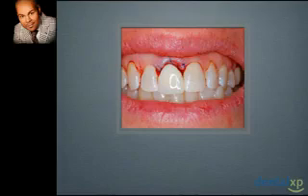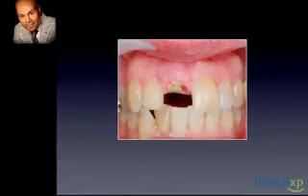So what I attempt to do here is to graft this, use the flipper to help me mold the tissue, and you can see some of the extrusion of that graft from the socket, and we'll allow that to heal. Typically at about 10 days, you'll see this area where you do have epithelialization of the keratinized margin, and you will get some necrosis of the direct middle portion of this.